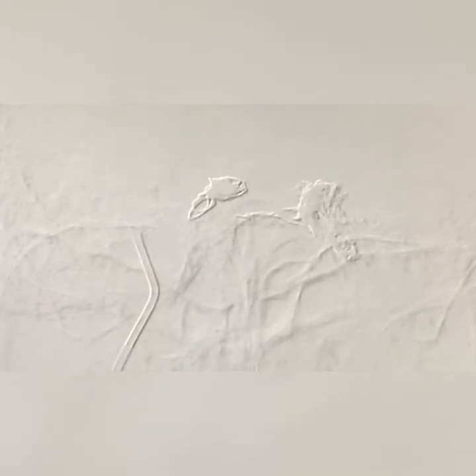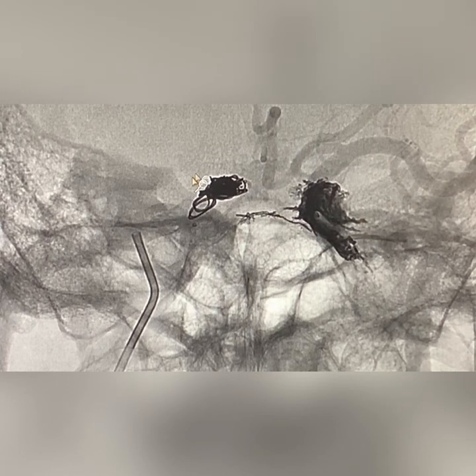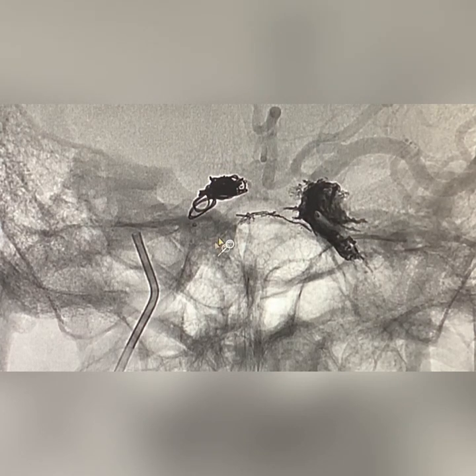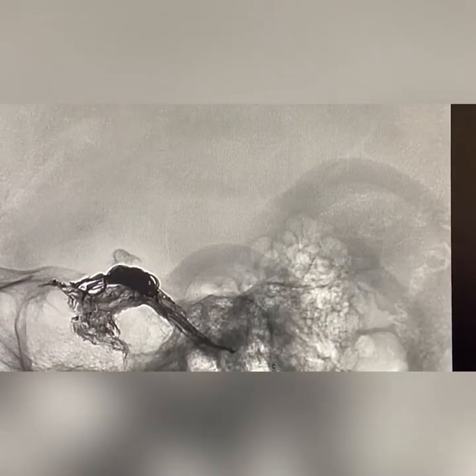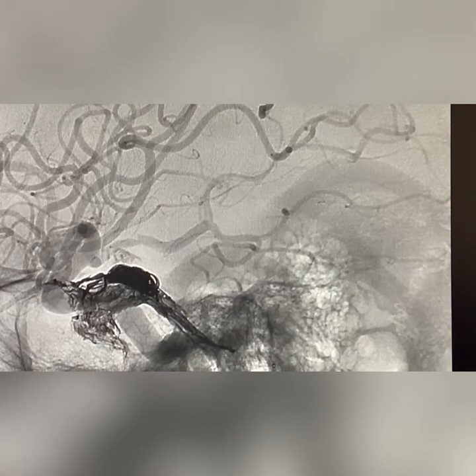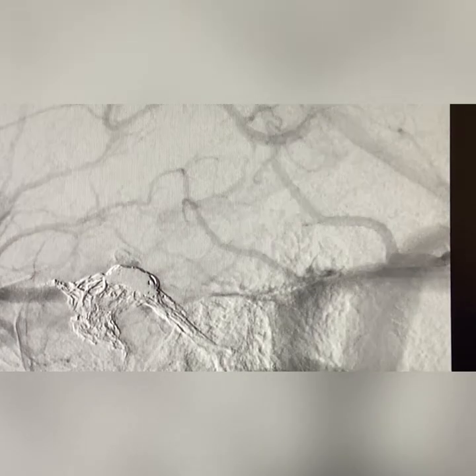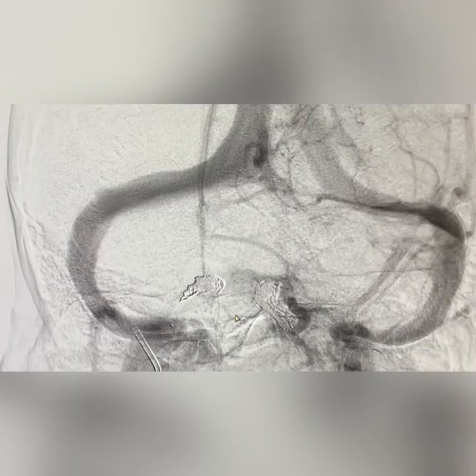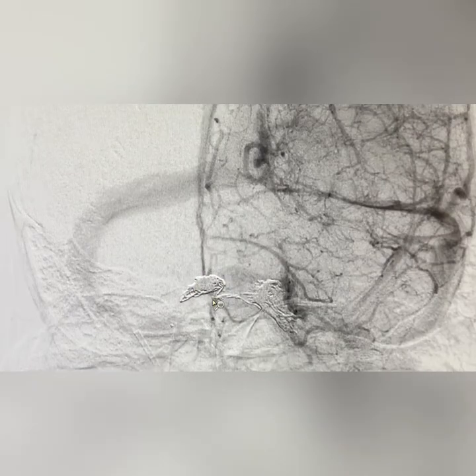We continue coiling until the fistula is excluded from the circulation, though there is still some filling noted. Clearly visible on imaging is the left part of the cavernous sinus and the right part of the cavernous sinus — both completely occluded. We check the angiogram at this point; there is still some residual filling, so additional coils are deployed. After deploying several coils into the right side of the cavernous sinus, the angiogram confirms complete exclusion of the fistula on both sides of the cavernous sinus.